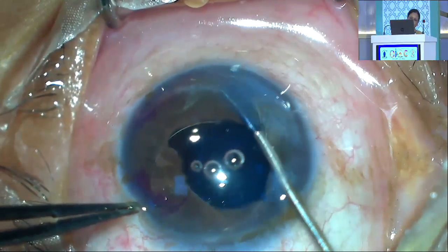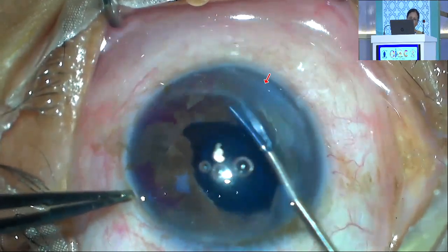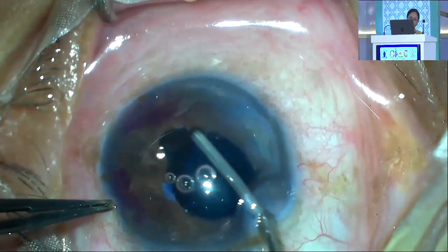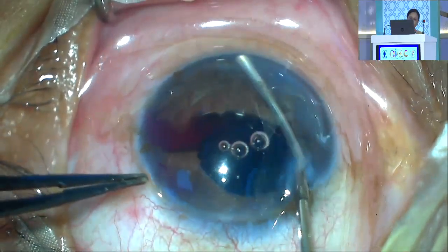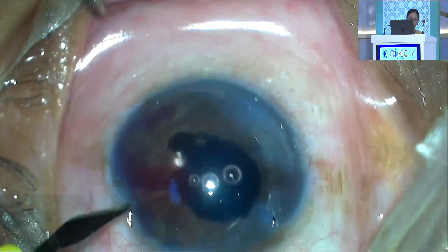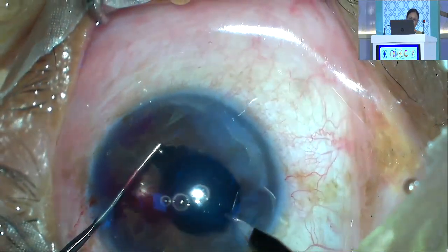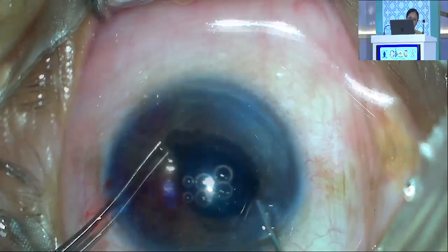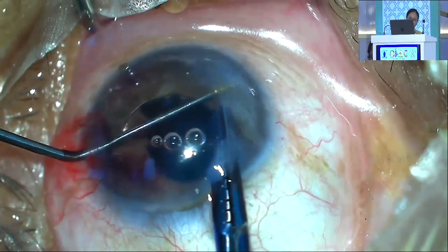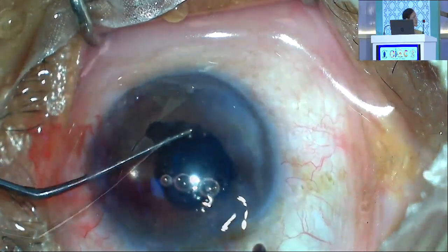Next, I tried to cut the fibrous tissues wrapped around the haptic to make it free from the iris fibers with micro scissors and tried to gently pull with the dialer again, but it did not work. At this moment, I planned to cut the inferior haptic from the optic with an IOL cutting scissors. Another side port was made at 2 o'clock position and the previous one was enlarged. Viscoelastic was injected, stabilizing the inferior haptic with the dialer. The cutter was used to cut the haptic at the haptic-optic junction and the optic was successfully separated.